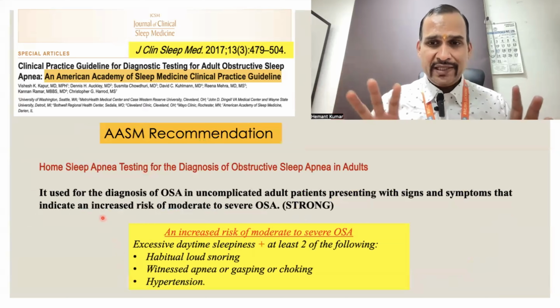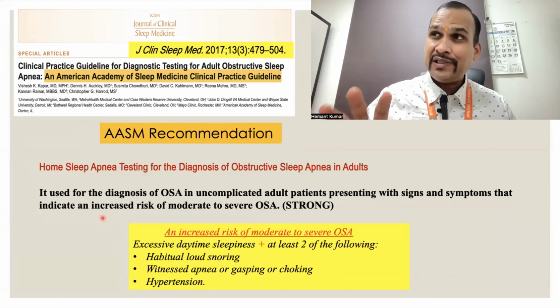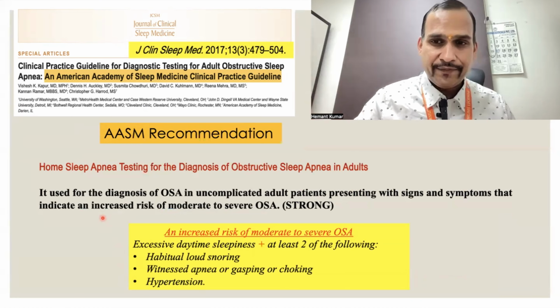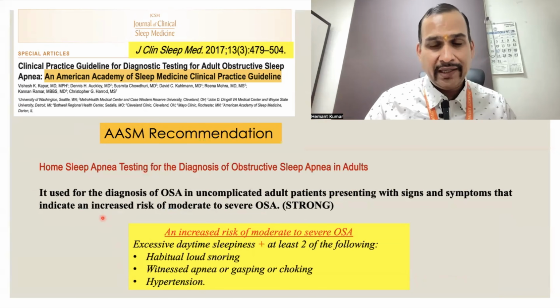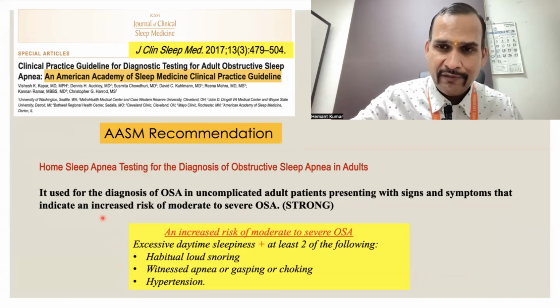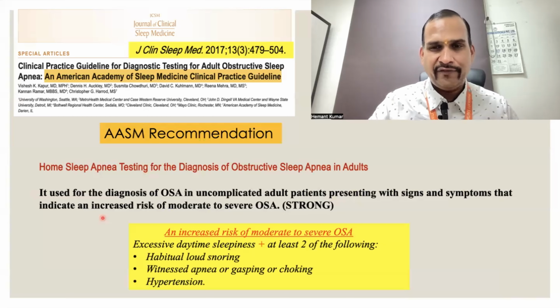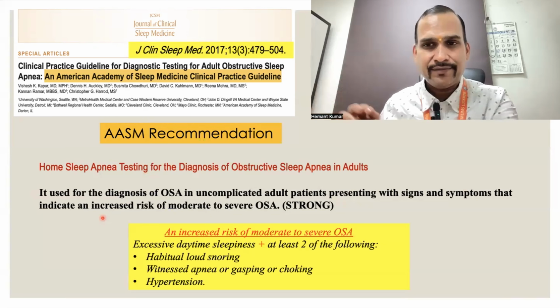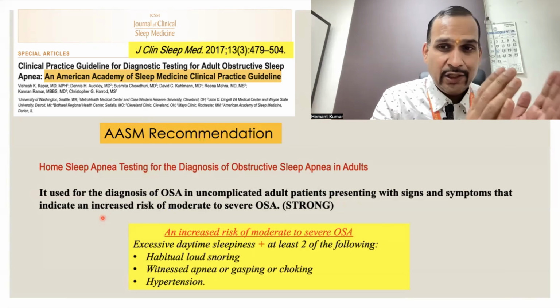If the patient is having severe OSA, then okay. Say for example, if the patient has an AHI of 80, this machine will tell 70 or 60, again falling in the severe category. If the patient has an AHI of 50, this machine will tell 40 or 35, still high. If the AHI is actually 15 or 20, this machine will tell 10 or 5.